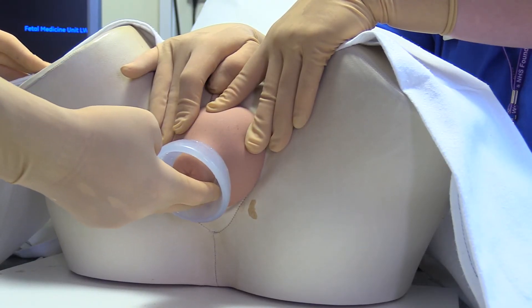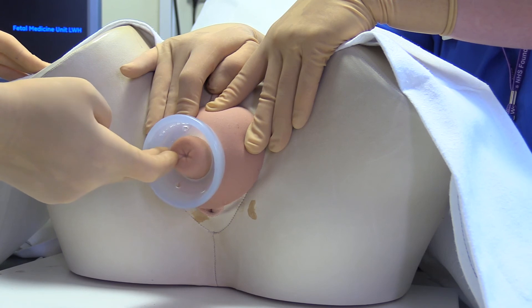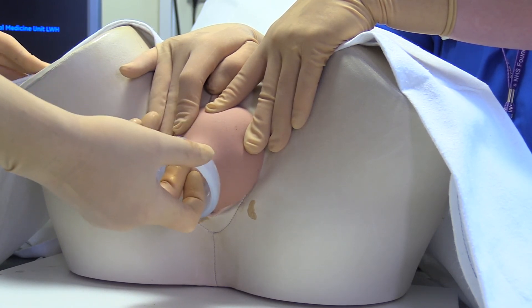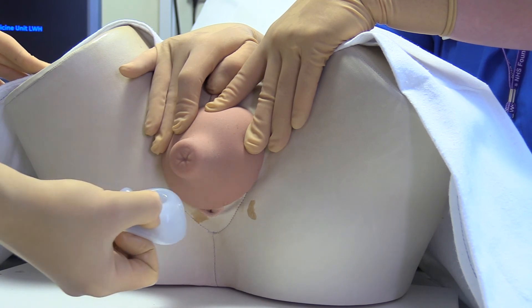Identify the cervix in the central portion of the dome, then hook the index finger under the pessary anteriorly. Gently bring the pessary over the cervix and remove it from the vagina.